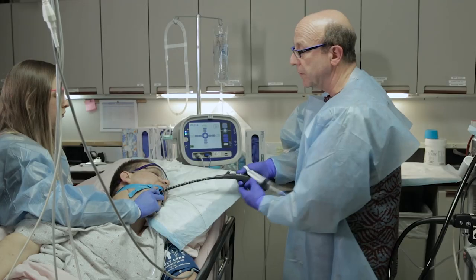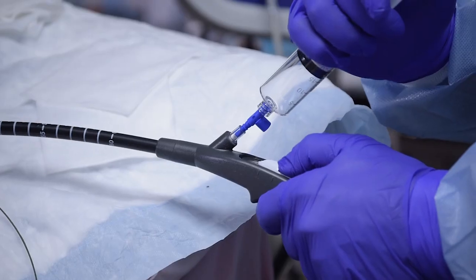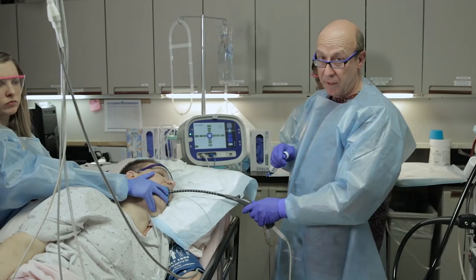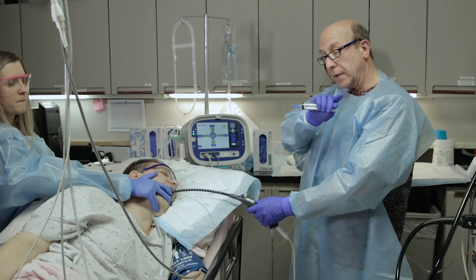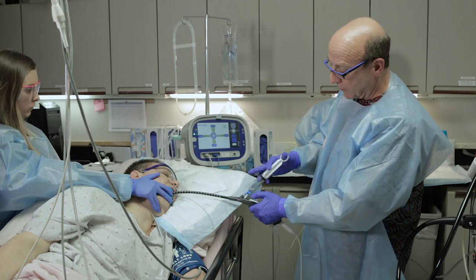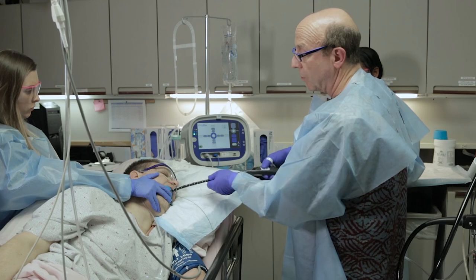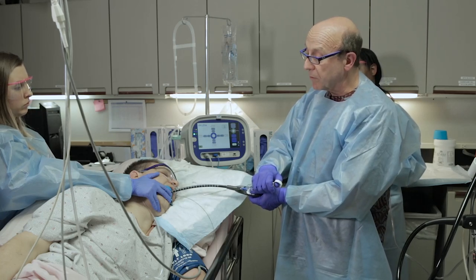We're now halfway through the esophageal treatments, down at the z-line junction between the stomach and esophagus. This is where the sphincter muscle becomes quite thick and we start to see differences in the impedance readings — much lower readings, closer to the 90s and low 100s, because the muscle is thicker and the needle is encased in more muscle each time. When we remove the catheter, it's always important to remove the needles while the balloon is still inflated and pull them into the catheter — this avoids causing perforation of the balloon with the needle. We don't put the needles back out again until the balloon is fully inflated.